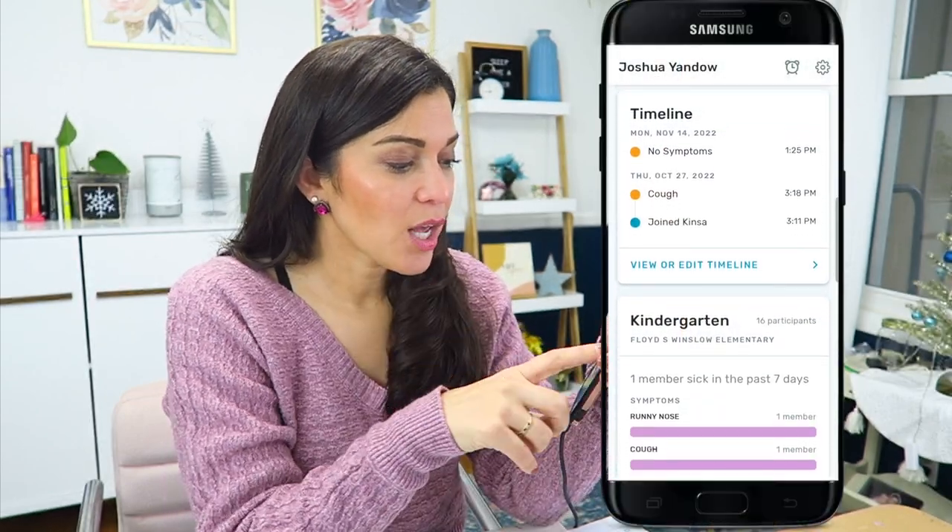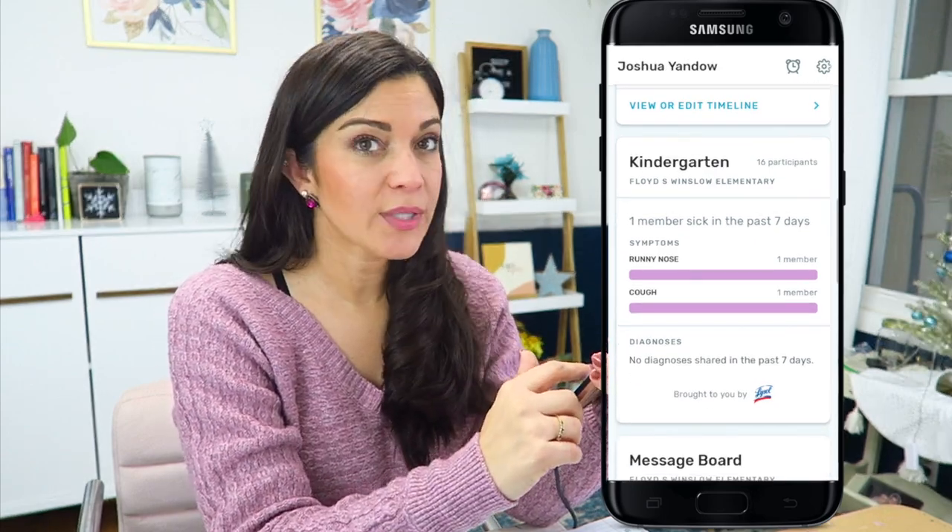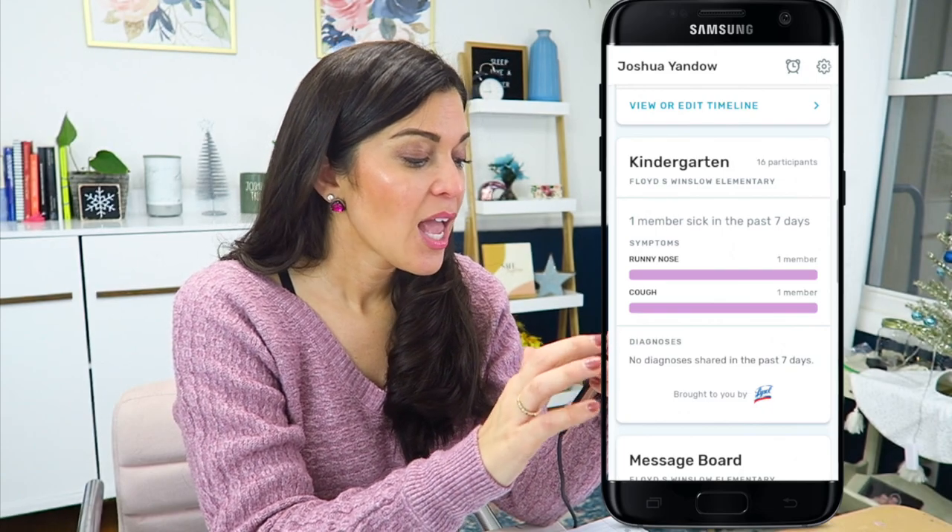So in a nutshell, that's basically how it works. You're getting a real time reading on your phone, but when you have a kid in a classroom or in a school, it also takes you down to their grade level. So everybody in kindergarten in my kid's school — there's one member sick in the past seven days, one symptom of runny nose, one symptom of cough, no diagnoses in the past seven days. And then there's a message board. You can actually see specifically per grade. I have a kindergartener, a second grader, and a third grader, and I can see all of the sicknesses that were reported in every grade level.